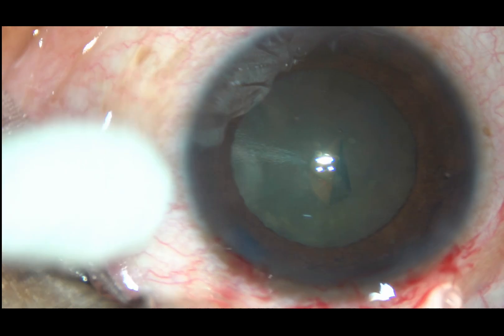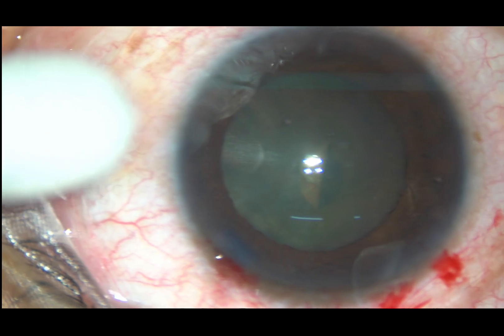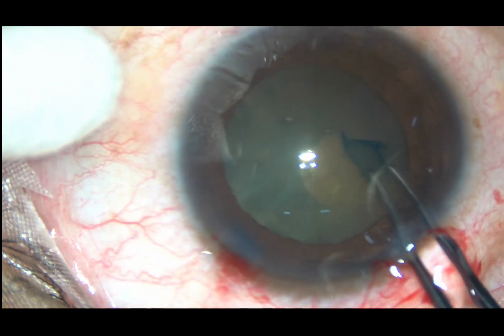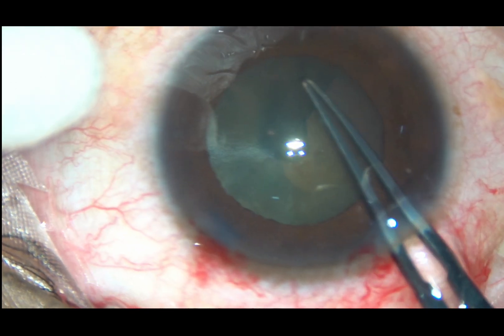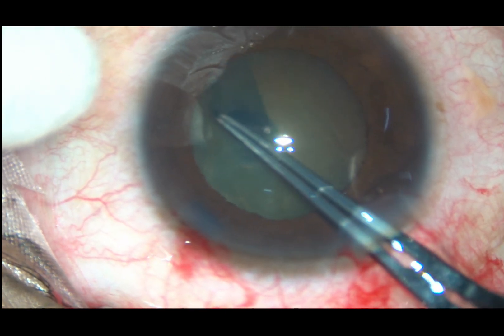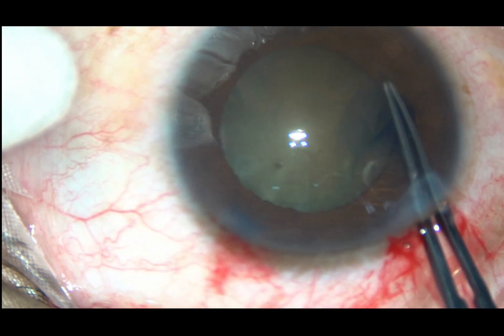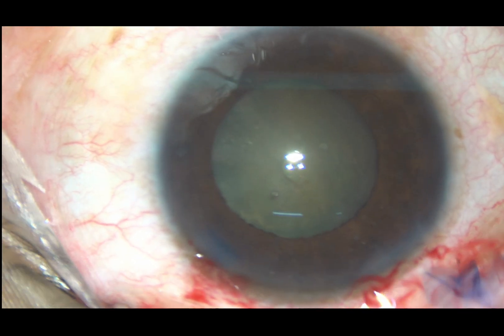Capsulorhexis is being done. The capsule has been incised with the 26-gauge cystotome. Now Utrata forceps is being used to hold the capsular flap. I go anti-clockwise. In this case I am going very close to the margin of the pupil because the pupil is about 6 mm in size. We have got a rhexis of adequate size, about 5.5 mm in diameter.